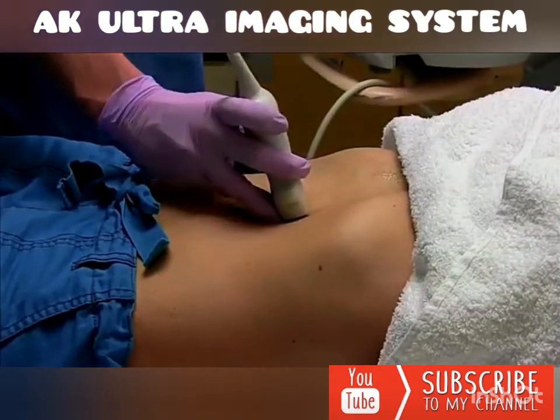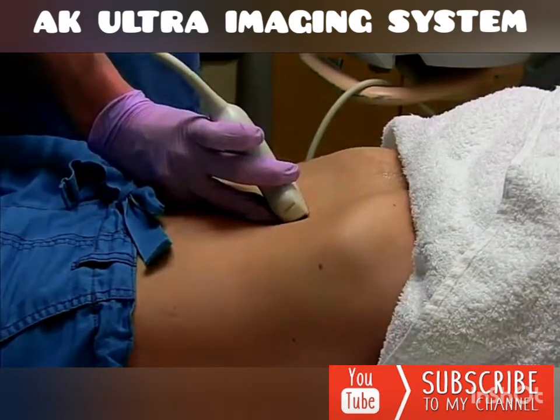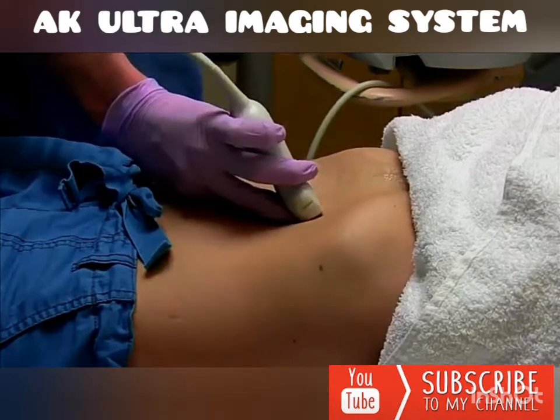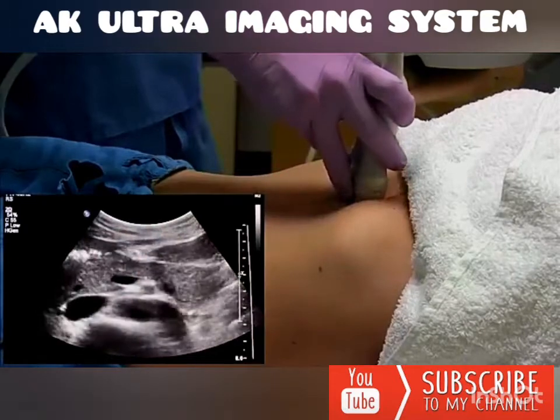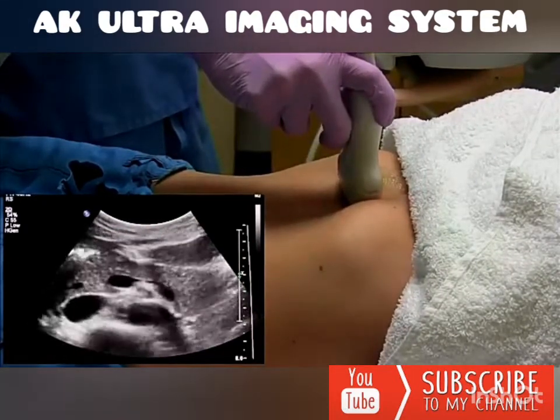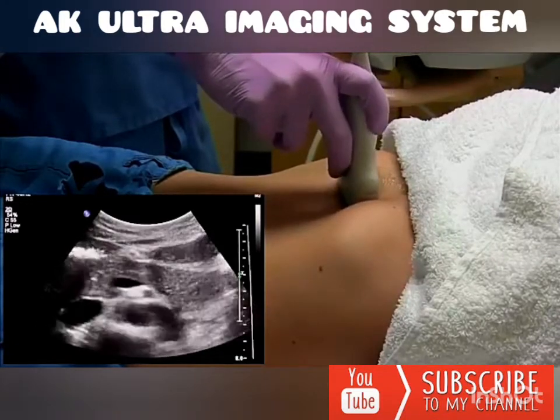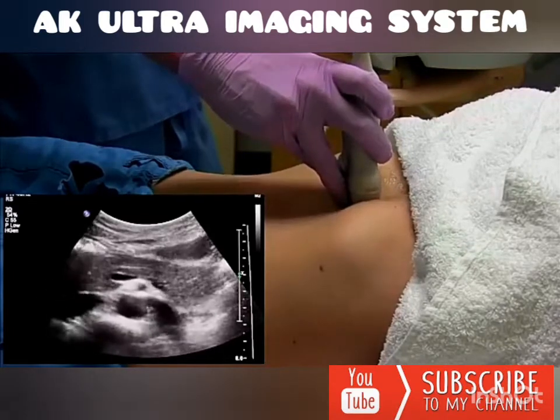Instead of coming down low and angling up, where you're going to use bowel, which is never a good scan window in ultrasound. So we're going to come up high, angle down, and the other key is to oblique your transducer slightly counterclockwise. This will set you up for a nice sagittal pancreas image.